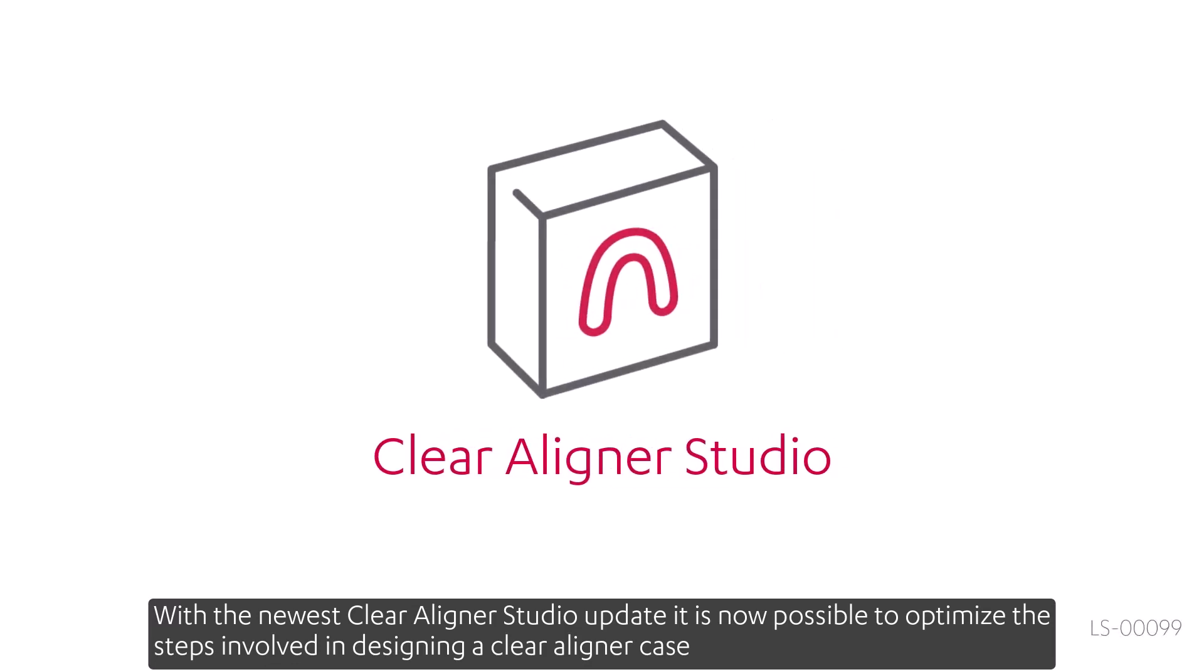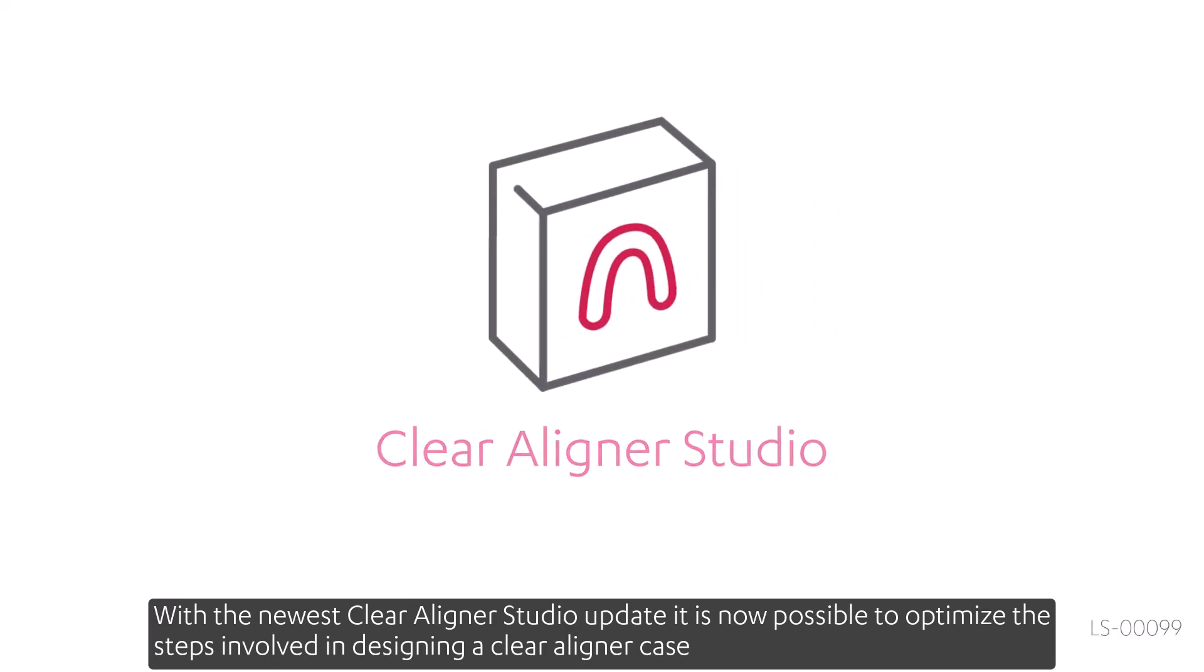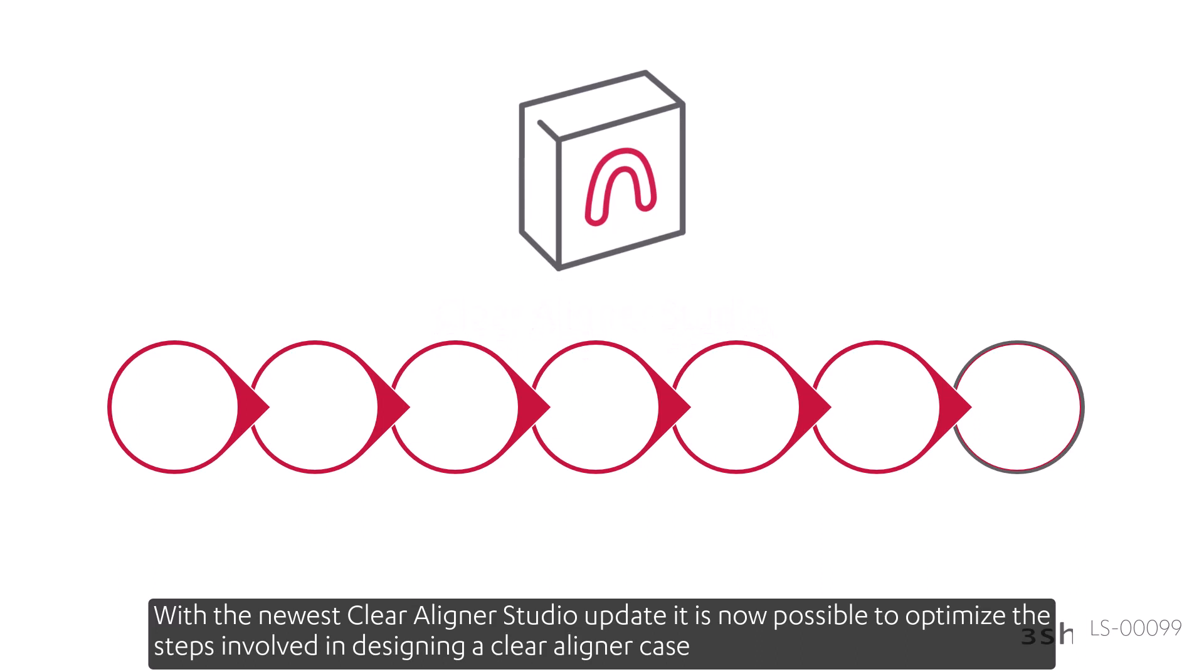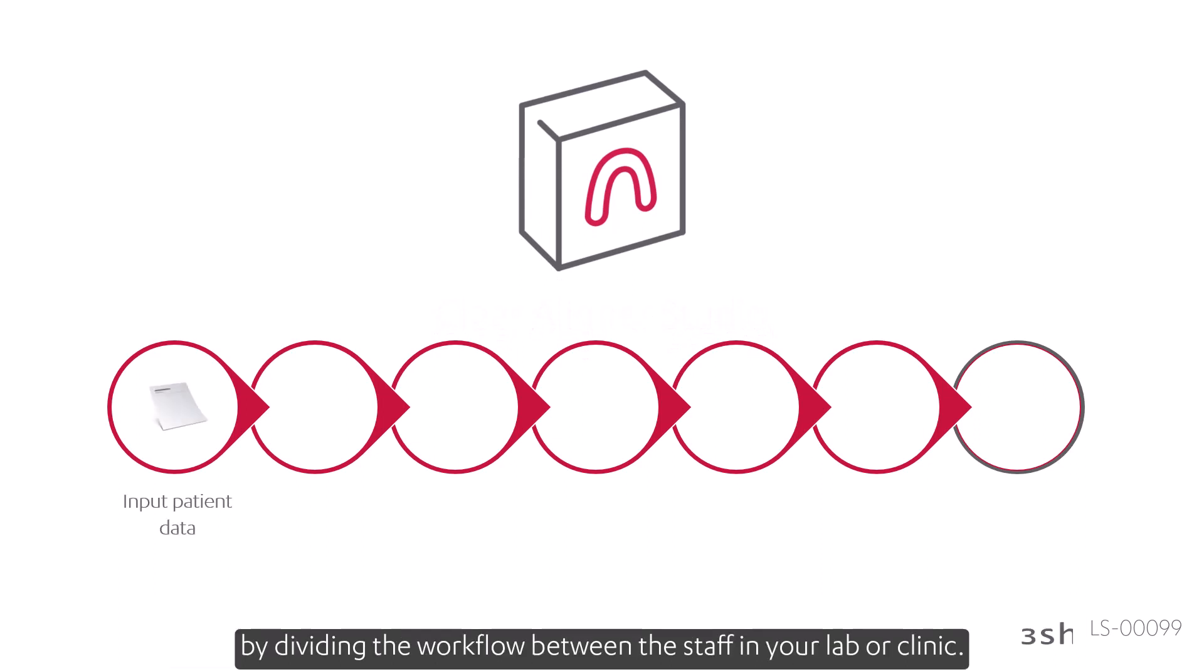With the newest Clear Aligner Studio update, it is now possible to optimize the steps involved in designing a Clear Aligner case by dividing the workflow between the staff in your lab or clinic.